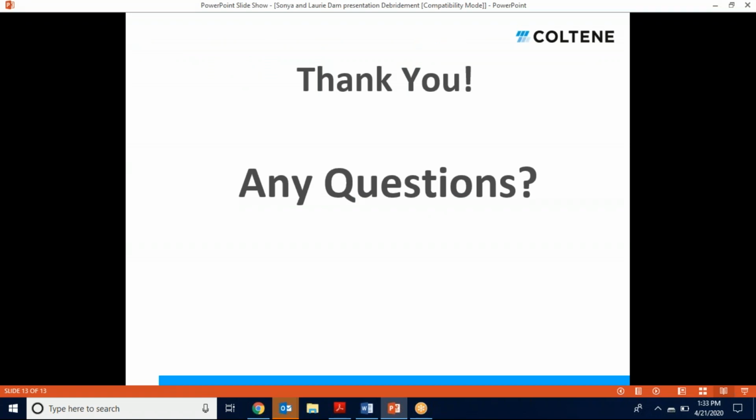Laurie, "never put a rotary file where a hand file hasn't been." That's great advice. Love that. And the other thing, Sonia, with the H files: maybe I knew this at one point, but you really emphasized that the H file is used in a push-pull motion and used mainly in retreatment. Something I really didn't even consider. So great job on hand files.